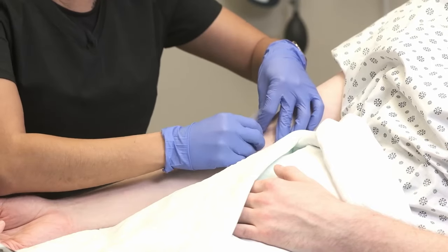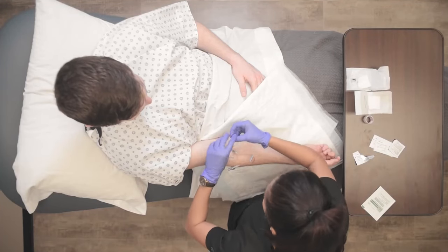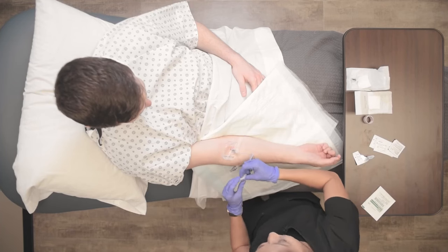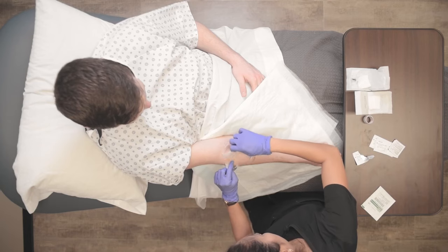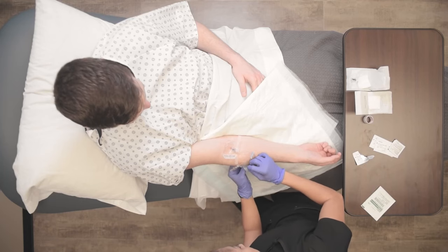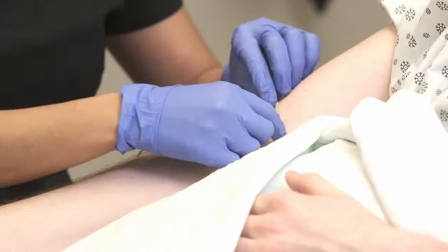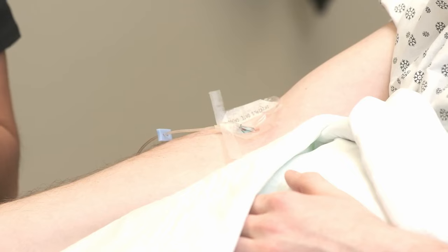Notice how I'm putting the skin taut — that will help peel back the dressing. I like to peel up all the corners so that the insertion site is the last thing showing; that way it keeps it covered as long as possible. Be gentle with patients who have arm hair, male or female. Now that I have all that peeled up, the insertion site is still covered — I like to not uncover that until absolutely necessary.